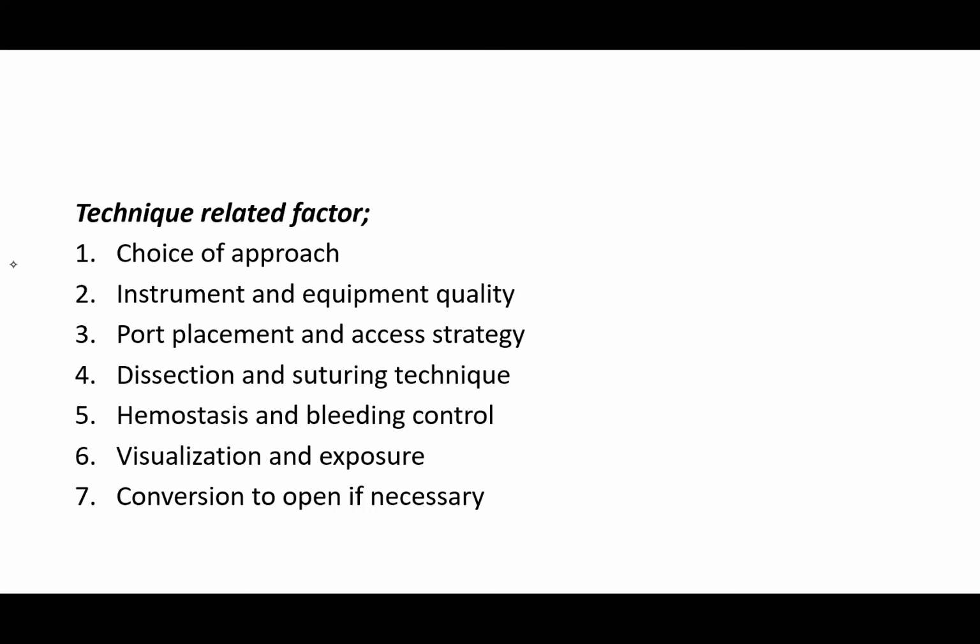So you keep on practicing, and the more you practice, you'll be surprised how fast you can become very good and proficient with all this procedure. Then hemostasis and bleeding control. If you have a facility or instrument that can give better hemostasis or bleeding control, the outcomes are better than you struggling with an archaic instrument that is provoking more bleeding. Then visualization and exposure, then conversion to open if necessary.